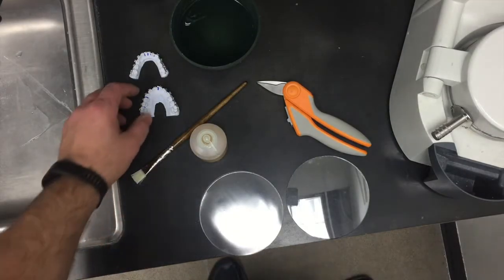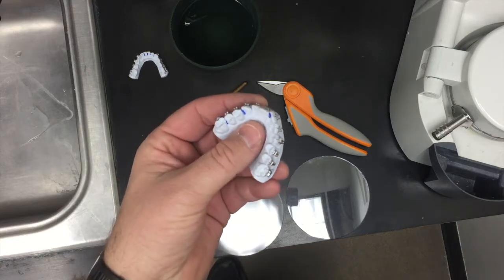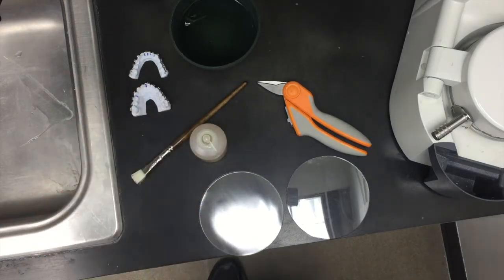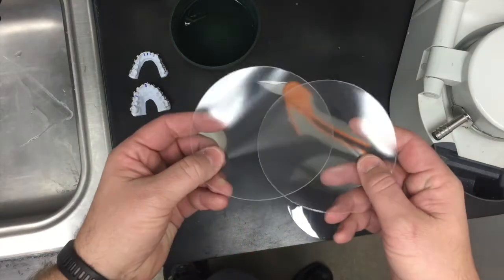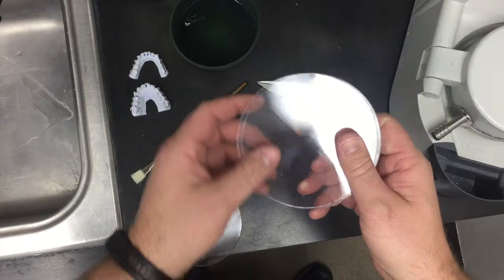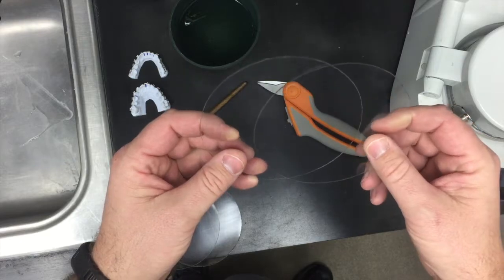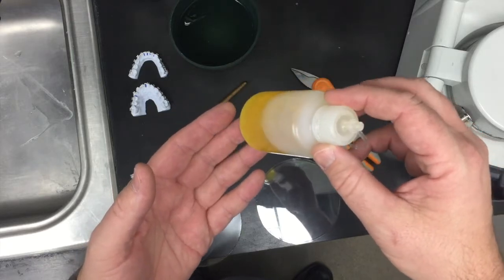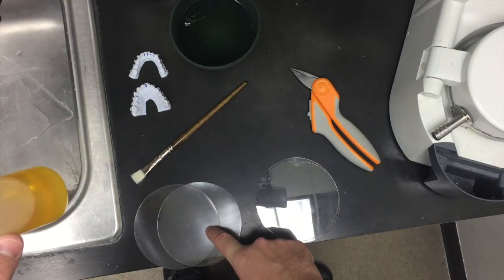Our models are now dry — at least the frosting on the models is dry — and we can continue making our indirect bond trays. Some of the things we need are obviously the models. We have one millimeter sports mouth guard material, which is really flexible — that's going to be the inner tray. And then one millimeter Essex, which is stiffer — that's going to be our outer tray. We'll also need a pair of scissors. In here we have PAM oil, and that's the separator between the hard and the sports mouth guard material so they can separate.